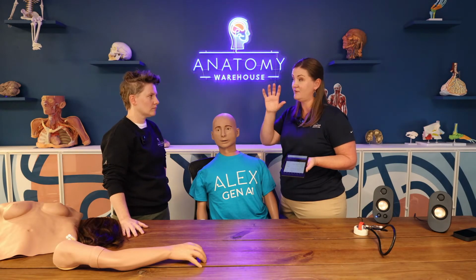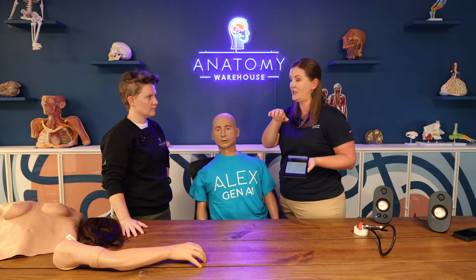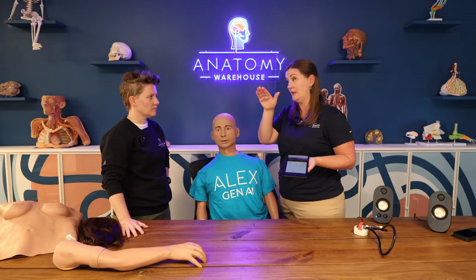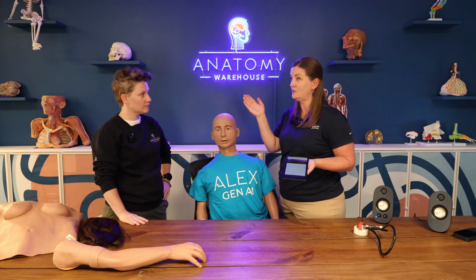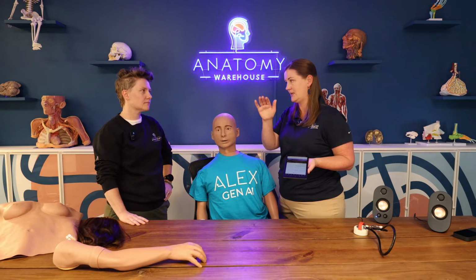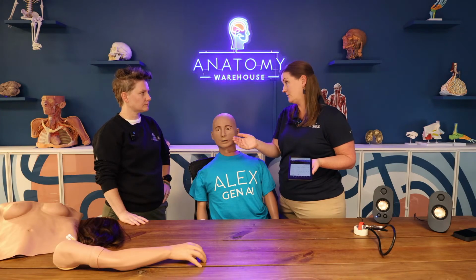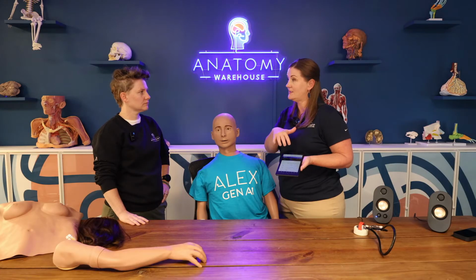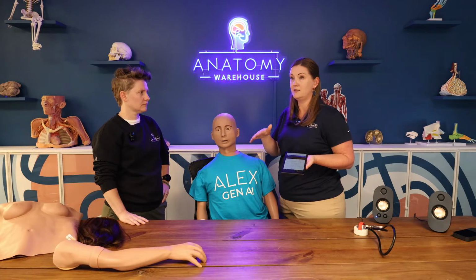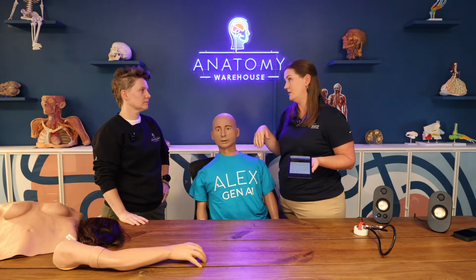And the AI is very generative throughout, so they can type in the questions that they want to be asking the patient, and then the AI will populate answers. Not to say that Alex is stuck with those answers. They can absolutely delete and say, you know what, no, I don't want that patient to say that, I want them to say this. But anything that they change, they have to follow through in the script, right? So if they're going to change and say Andrew has been in a car accident and his wife's name is Bunny, then they need to change Bunny throughout the course of their entire patient that they're populating.